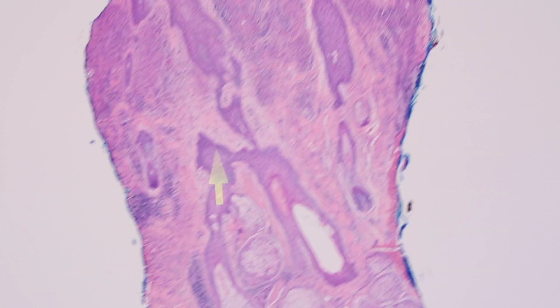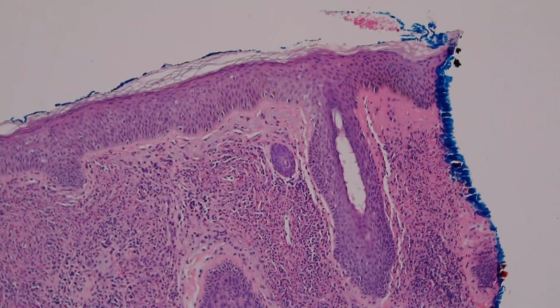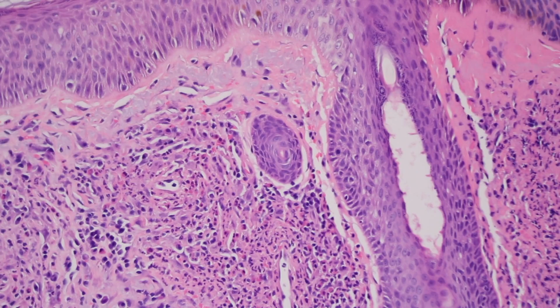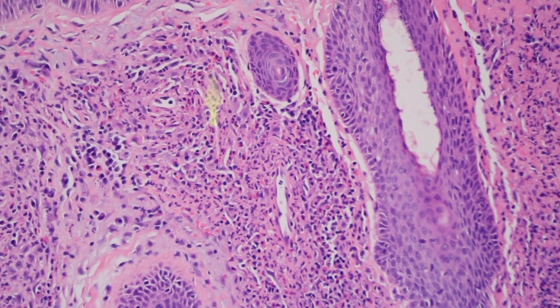So this is also from the face. Oh, and I dropped the slide. It's bound to happen whenever you're recording a video. And here, this is a punch biopsy. And on this one, actually, the vasculitis is much more apparent. Each vessel is really surrounded by a lot of fibrin and a lot of neutrophils. And additionally, you can begin to see kind of this swirling layering effect.